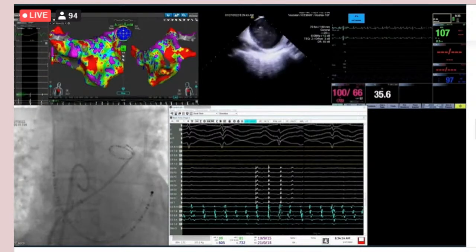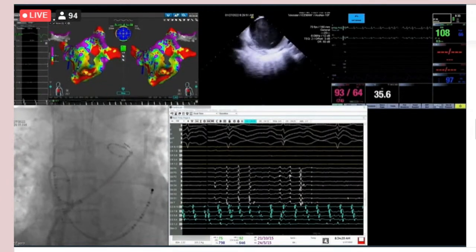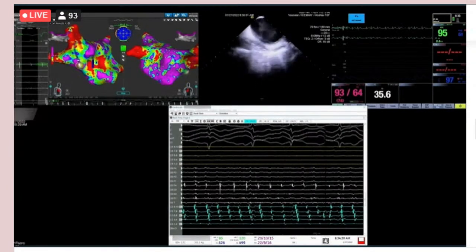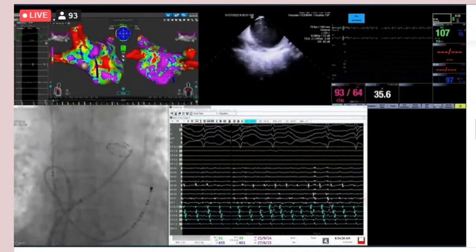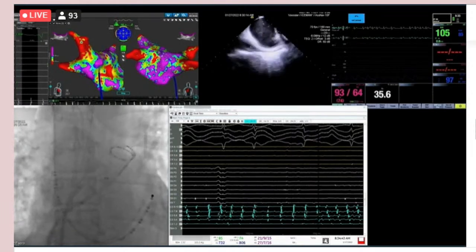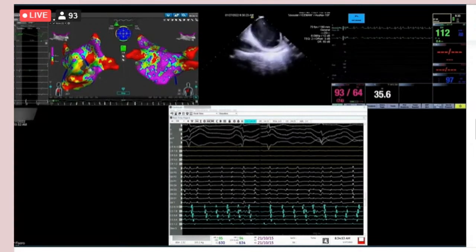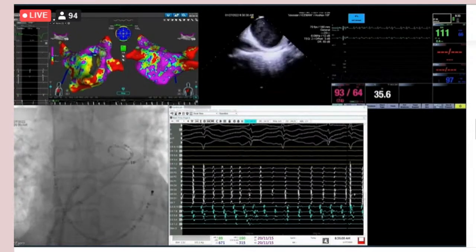The posterior wall is done all with electroporation, and there's actually a guide on the map that it gives you. You can see the purple, if you see the upper left on there, the idealized map, that is how they determine on that map what is outside of the realm of the esophagus and posterior wall. So in that purple area, if they turn that around AP, you would be able to say at those locations you can use RF, and the posterior wall, the grayish area, is all electroporation. You can also use RF along the lateral mitral isthmus if you need it for isthmus block.